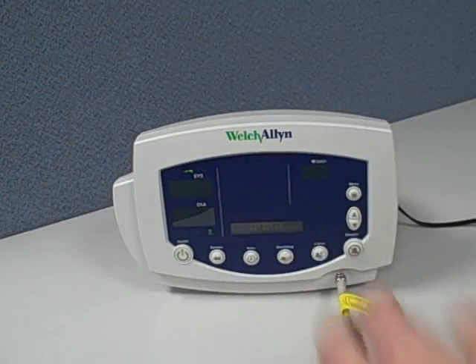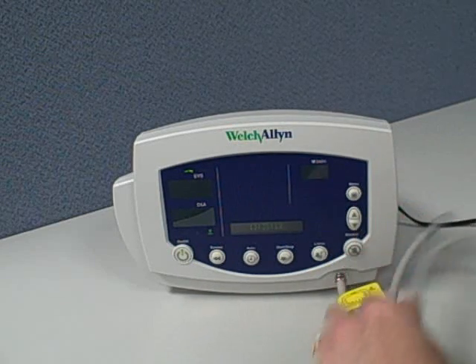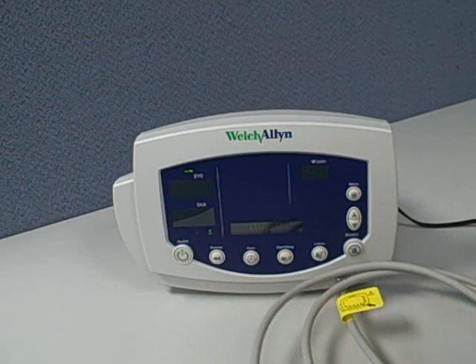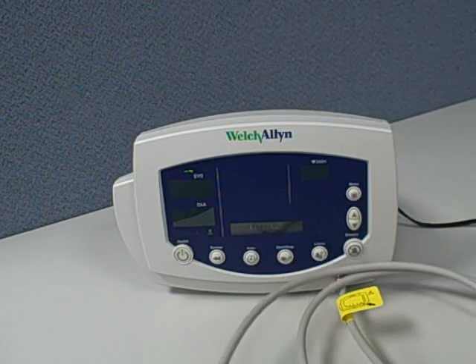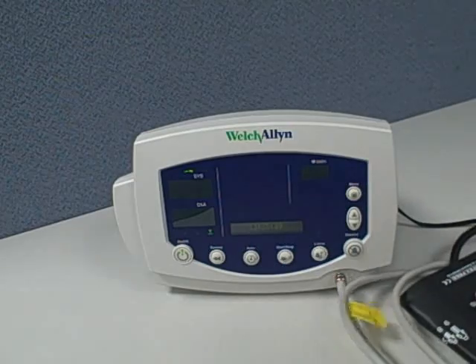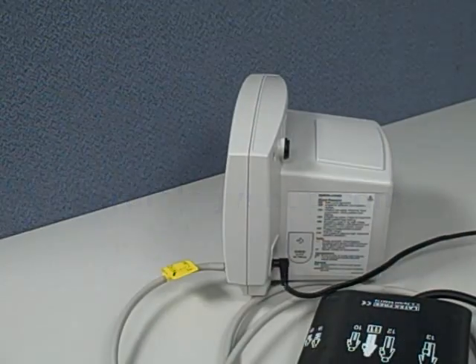For blood pressure, a six-foot extension hose is attached to the front and the cuff is attached to the end of that tubing. This can be used for just routine vital signs assessment or continuous monitoring. You can set programmable alarms and have it in an automatic blood pressure mode. A convenient list of common error codes is printed on the side for easy reference.